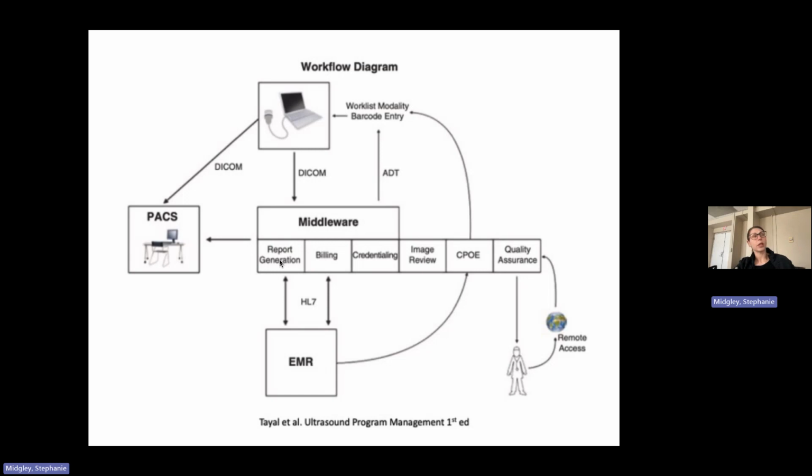So now you have your image interpretation, which can go to your EMR, and you can link your images to that report, easily viewable in your EMR without having to log into PACS externally. The other really nice thing is it can help capture billing, because now you have CPT codes associated with your interpretations. You can use it to track provider numbers: for residents, to make sure they're hitting their graduation numbers, and for privileged providers, to make sure they're keeping up to date with their studies, and for those trying to get credentialed.